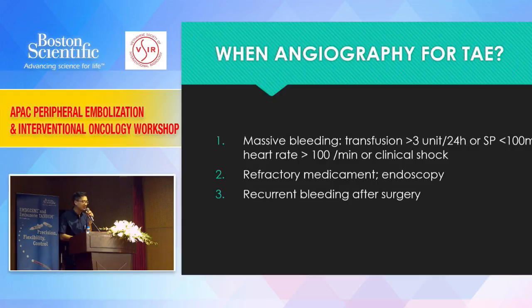The indication for angiography is when the patient has massive bleeding refractory to medical treatment or endoscopy, or has recurrent bleeding after surgery.